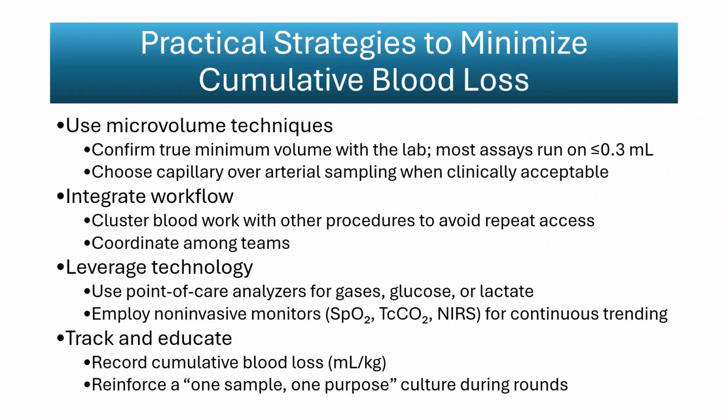Workflow integration is another important strategy. Clustering laboratory testing with other procedures, such as line access or medication checks, minimizes repeated handling and blood exposure. Communication between nursing, respiratory therapy, and the medical team prevents duplicate or unnecessary tests. Point-of-care analyzers further reduce waste by providing rapid results at the bedside using microvolume samples.